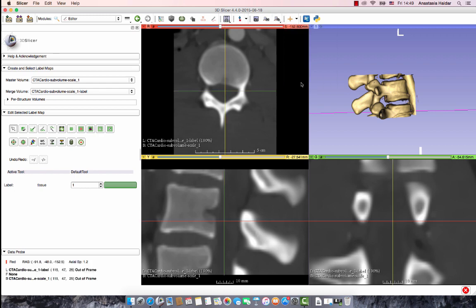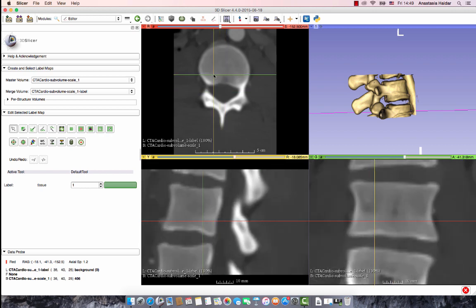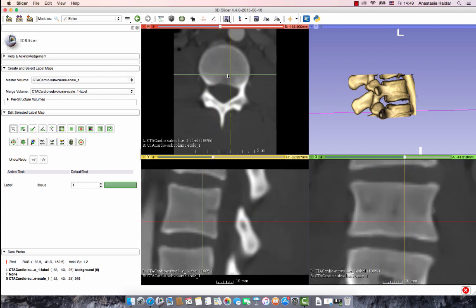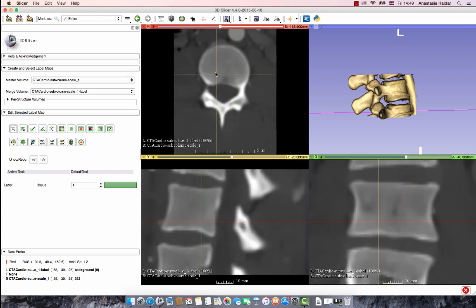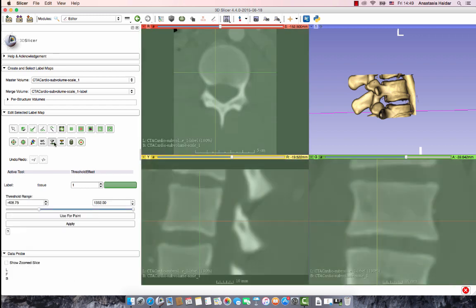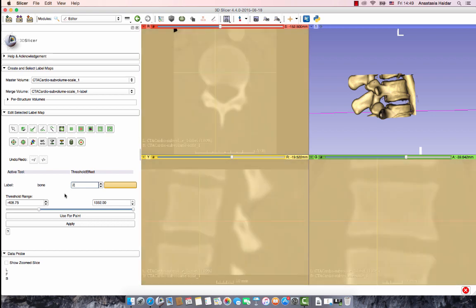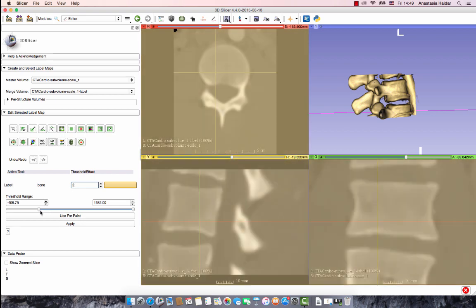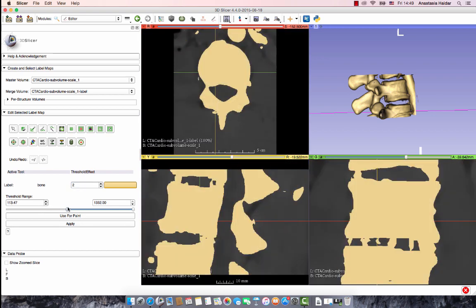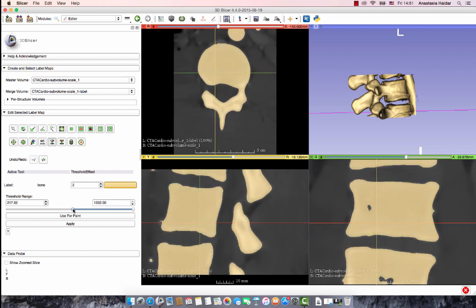Click on the Slice Intersections to show where each slice intersects in the different orientations. Hold down the Shift key and drag your mouse to any point on the slice to show where that point is. In the Editor's toolbar, click on the Threshold tool which allows, through a chosen threshold, to segment all the slices at once. Choose the best threshold that applies to your segmentation, then edit it using the other tools in the toolbar.